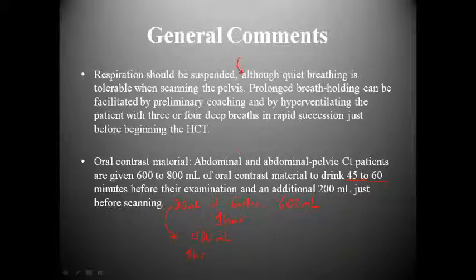The reason we need to allow the contrast medium to get to the rectum is quite simple. If you don't allow the contrast medium to get there, there can be some abnormalities such as rectal cancer, things like this, some weird mass down there, or also the patient could have free pelvic fluid if it's a female with a huge cystic mass type deal, and it's essential that you be able to distinguish where the rectum is and where this fluid begins and things like that.